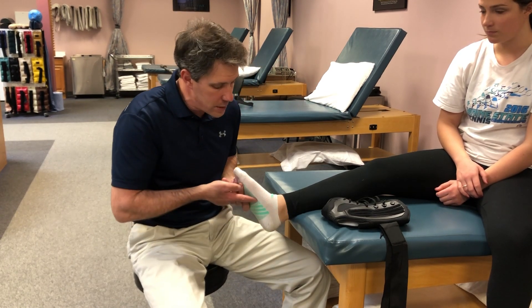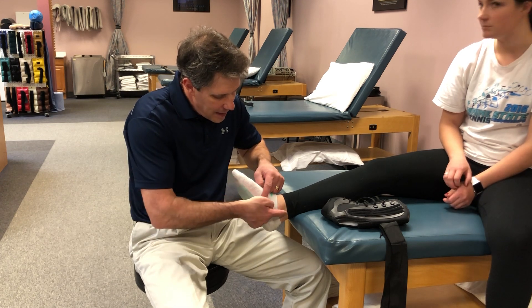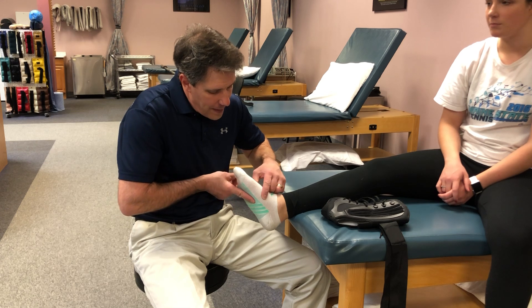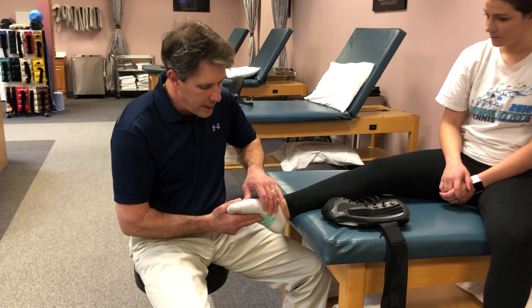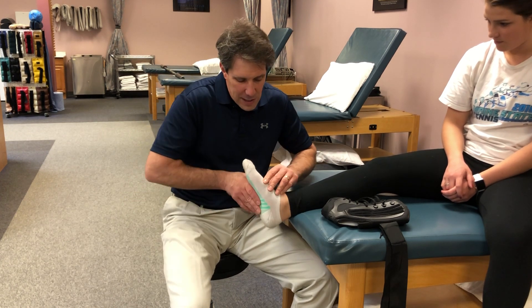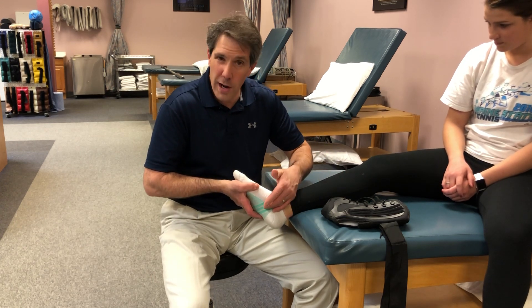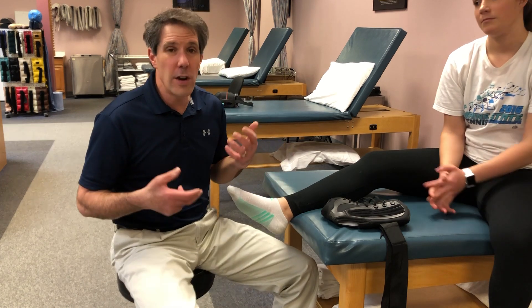This affects the posterior tibial tendon, which comes around this bone, attaches here, and has another branch that comes down and attaches to the bottom of the foot. They help to support the arch and help push the foot down. If you're doing a lot of running — say on a cambered road where the foot is going out to the side a lot — and this muscle isn't strong enough yet to support the arch well, you'll finish your run in a lot of discomfort.